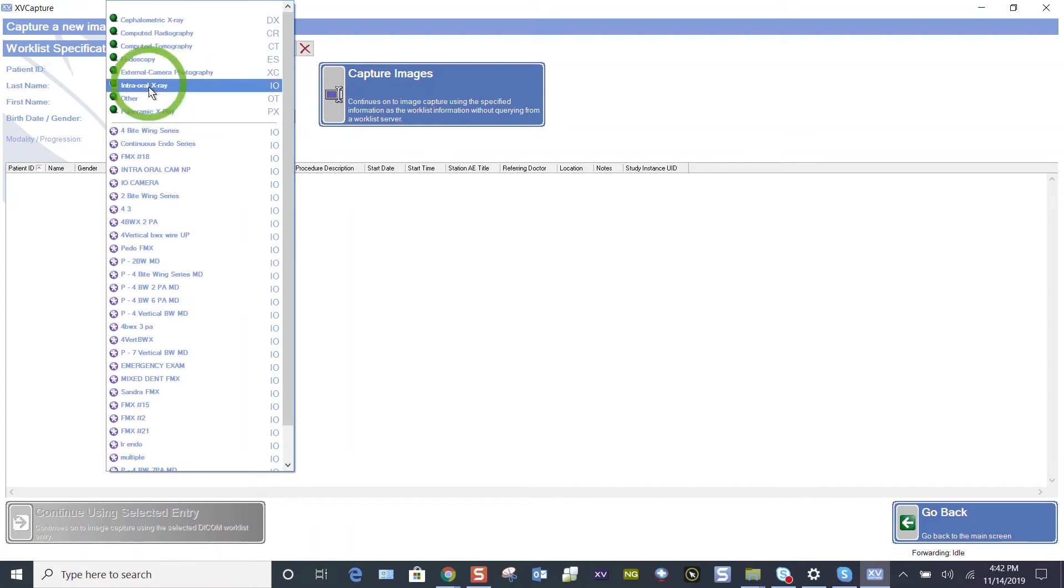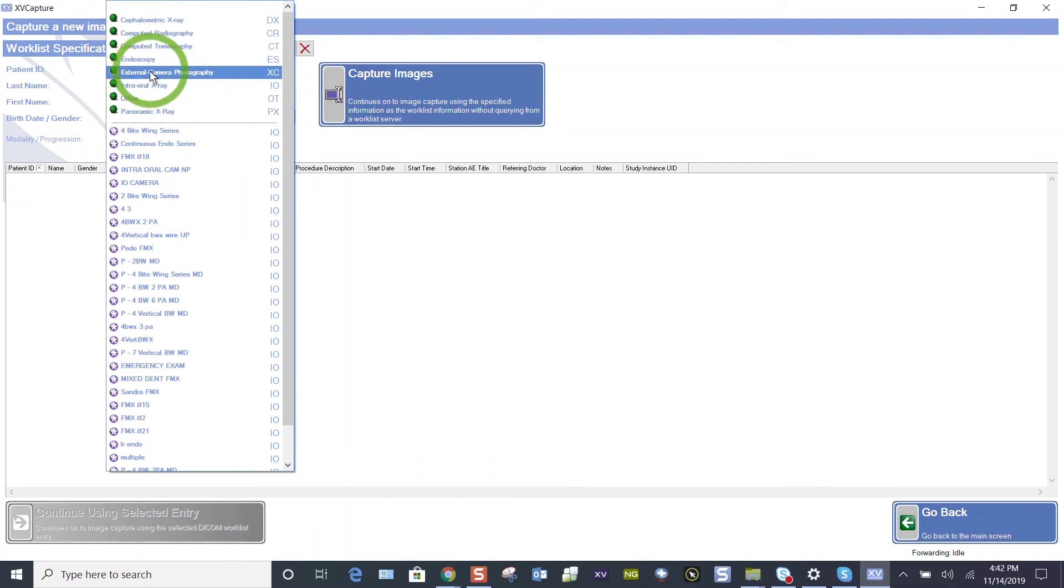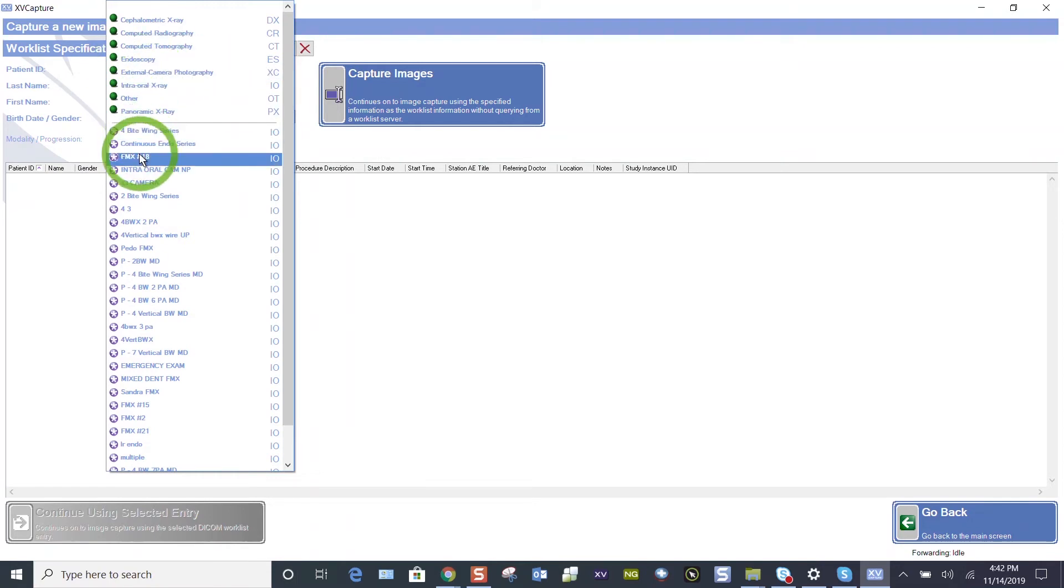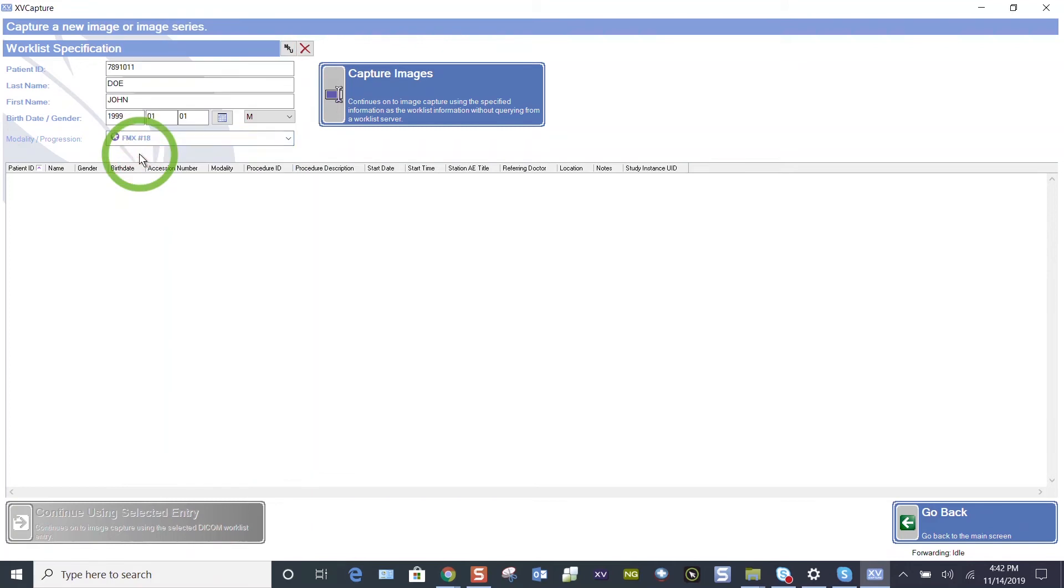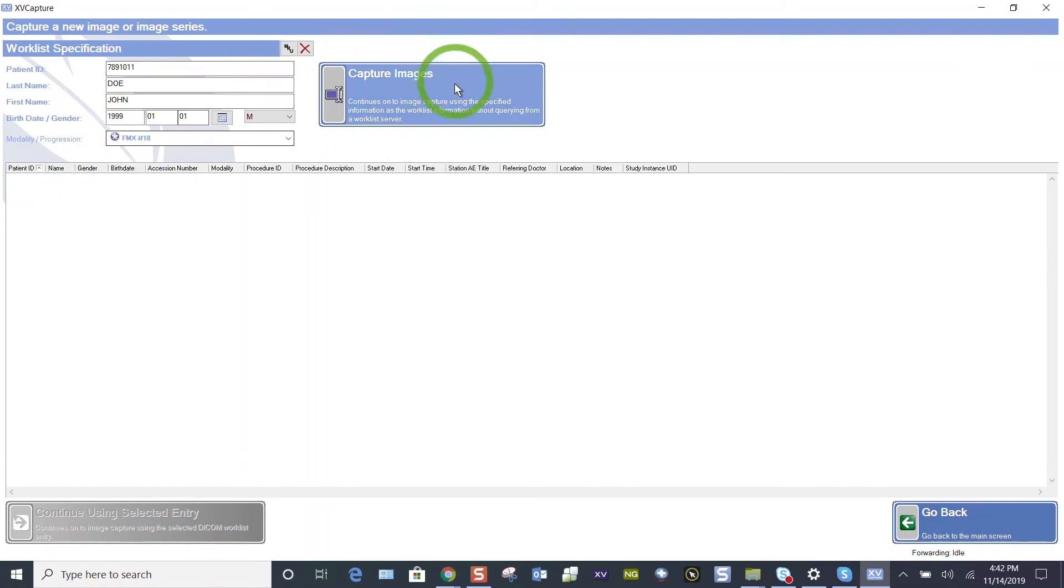You see the top part of this list is for your panoramic, your intraoral, your camera, which would be your intraoral camera. Let's choose FMX 18. Once we've verified who we're taking images on and we've decided on what type of images we're taking, let's click on Capture images.